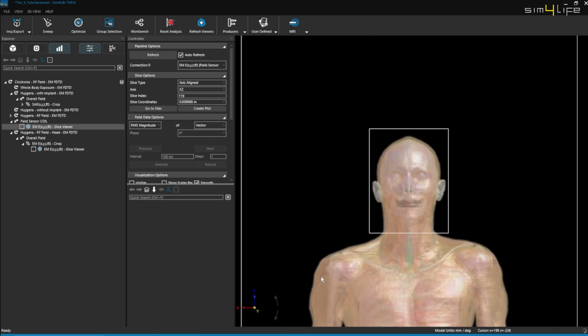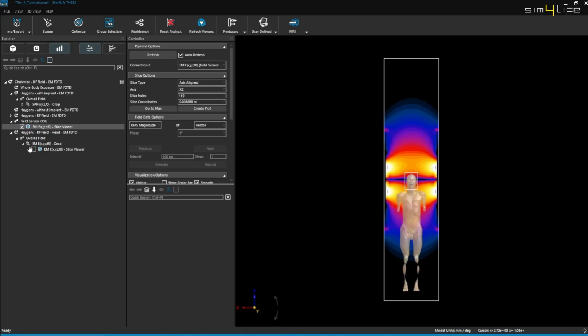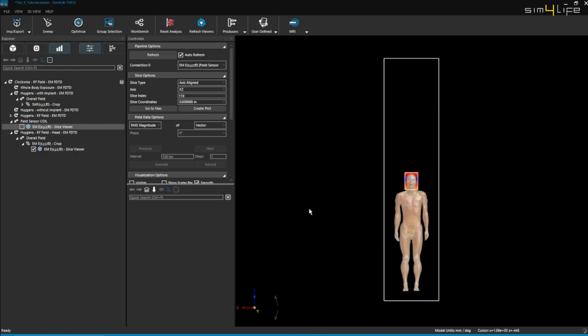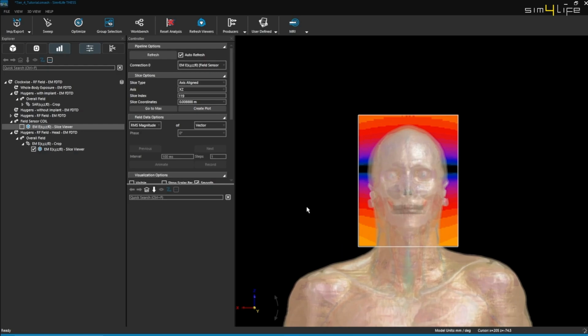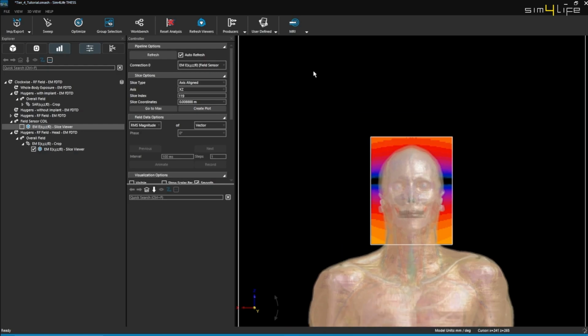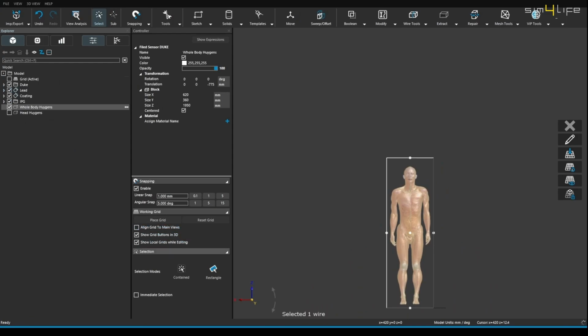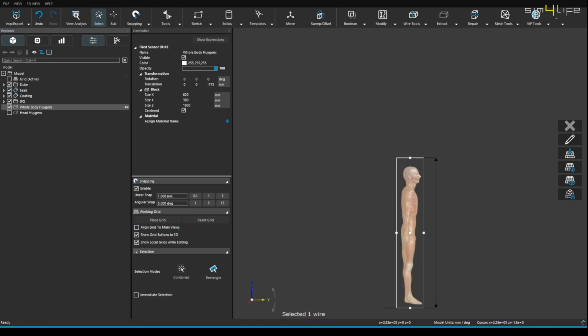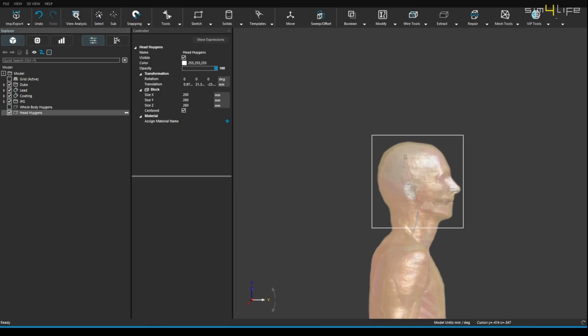To optimize computational resources, we will use the concept of the Huygens source. The Huygens source acts as a secondary source of the already calculated MRI fields from the empty coil and will be represented by wire boxes that enclose the regions of interest. We create two Huygens boxes, a whole body Huygens box that encompasses Duke's entire body, and a head Huygens box that surrounds the implant region in the head.